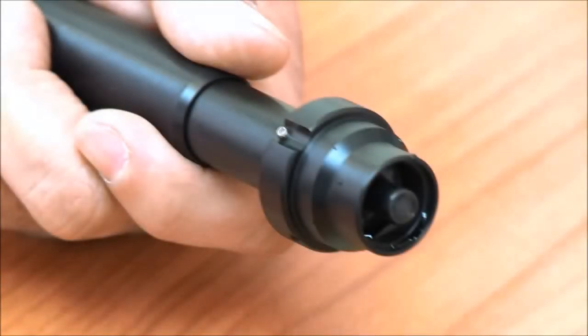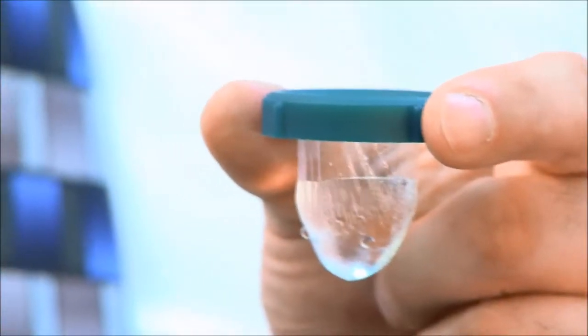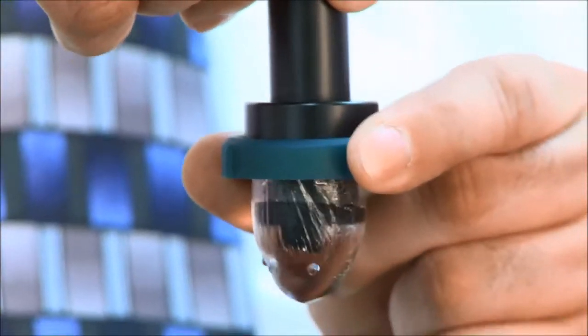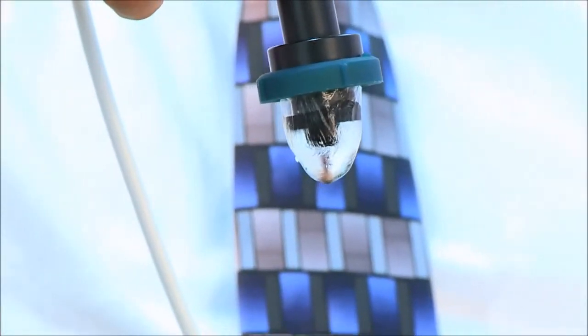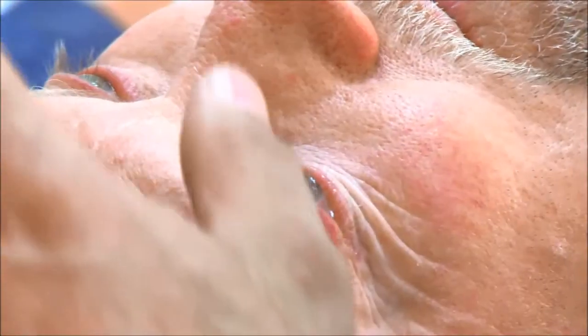The 40 MHz probe is open and the transducer is visible. The probe can be used in several ways. This configuration is for use with the ClearScan bag. The bag is filled with distilled water and the probe is inserted. The bag should be taut, but not hard. It must follow the contours of the eye. Put some tear gel on the bag to improve transmission of the ultrasound.